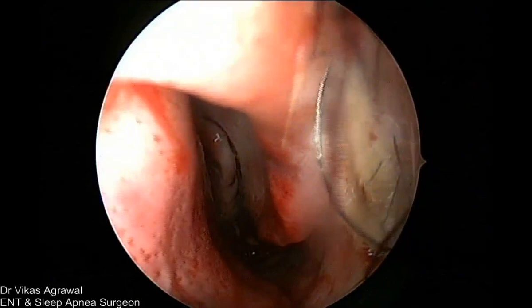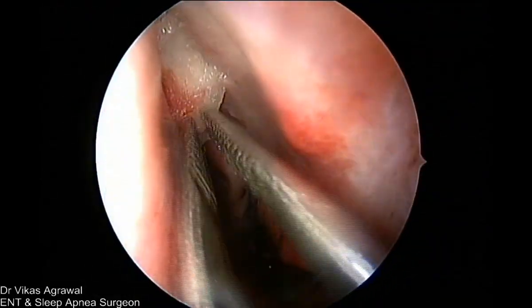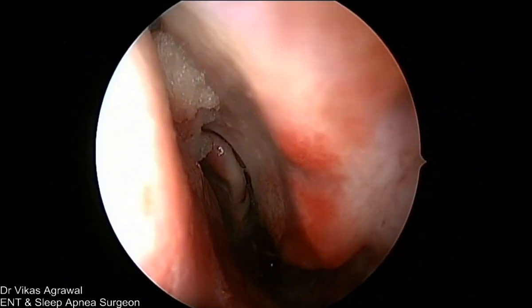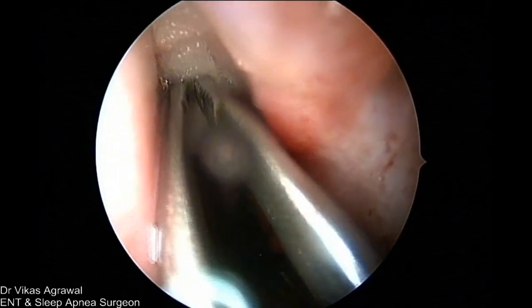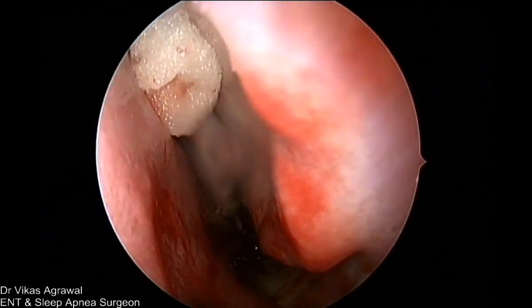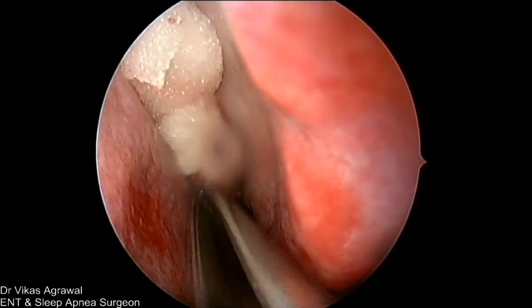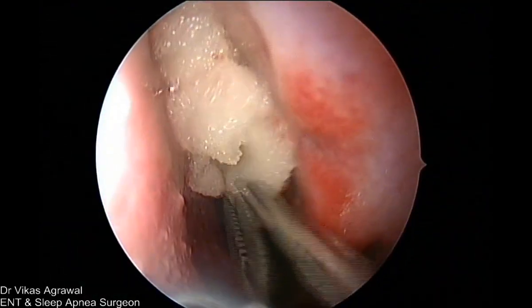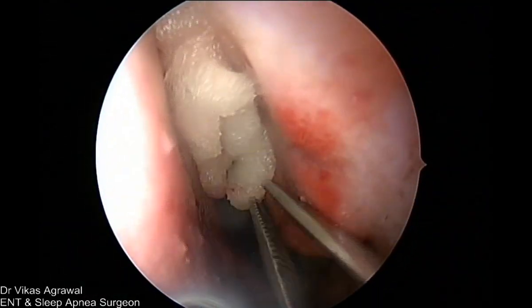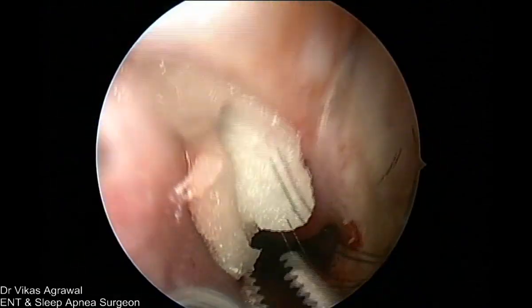So first of all, now I am putting gel foam soaked with a hemostat, Sepguard, to take care of the upper part of the septum from forming a hematoma. Because your pack is not going to be there. We are going to use either Nasal or I'm going to use Rapid Rhino with an airway. I'll show you that so that the patient can still breathe, but the upper part of the septum or even the sinuses you cannot take care of with the pack.